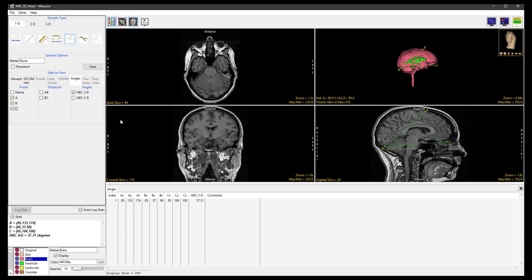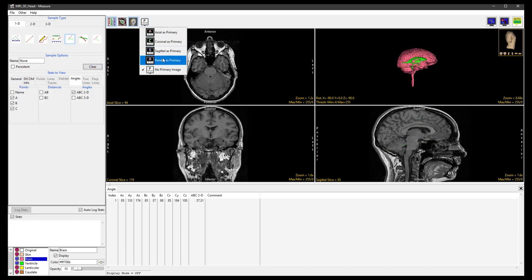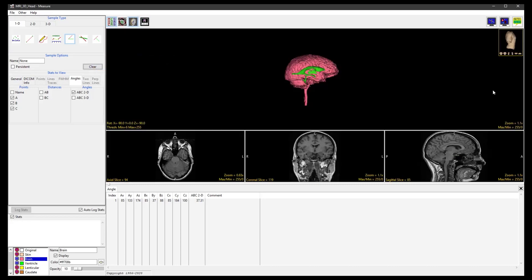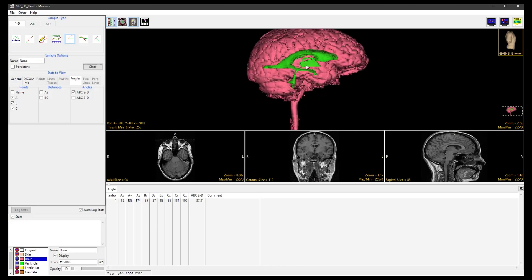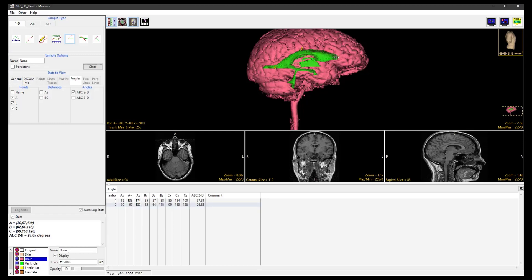Next, select Clear, set the render display as primary and zoom in to clearly display the ventricle object. Define an angle on the ventricle object by clicking three points A, B and C. The new measurements will appear in the Stats Review area and as a new line in the Stats Log.